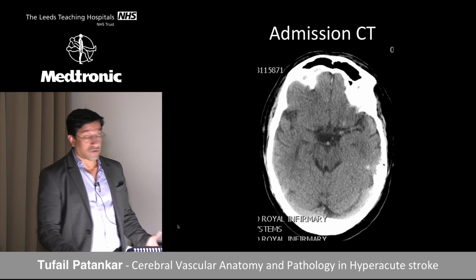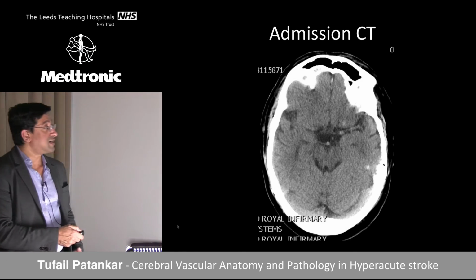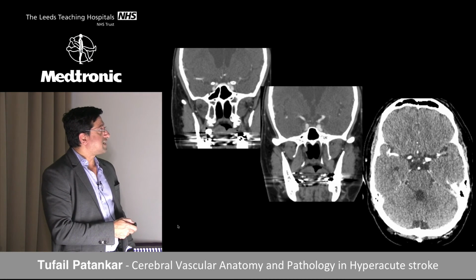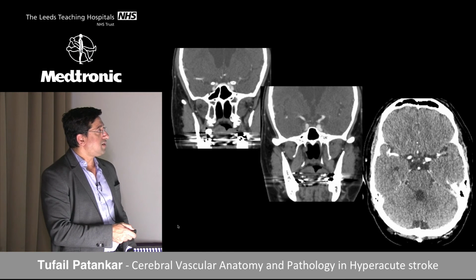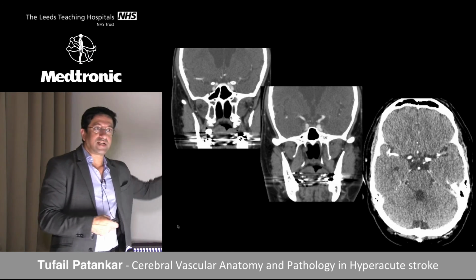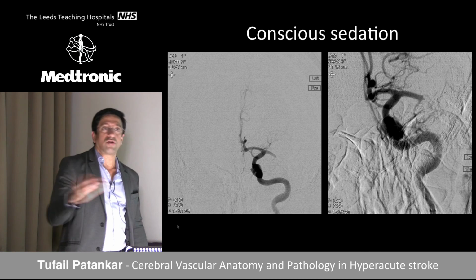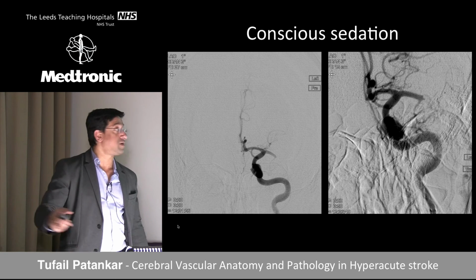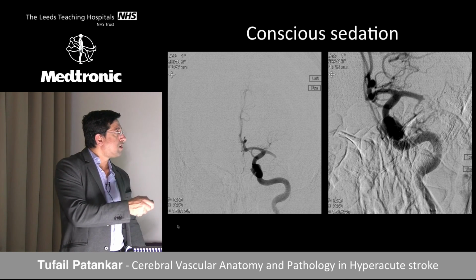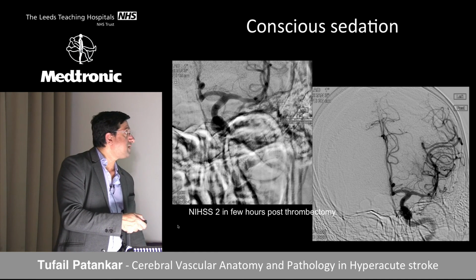When the stroke physician makes an attempt to call us, it makes a big difference. Look at that. He's got an MCA clot. He comes in, you get a CTA, you can see the internal carotid artery, and you see the clot there. This CTA was already done, and I just had to look at it and say it looked good. You look at the ASPECTS score, collateral score, which we'll learn. Internal carotid artery comes here, sudden block, no collateral here, anterior temporal branch is here, 10 minutes.